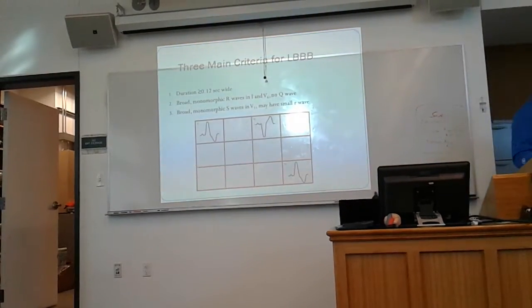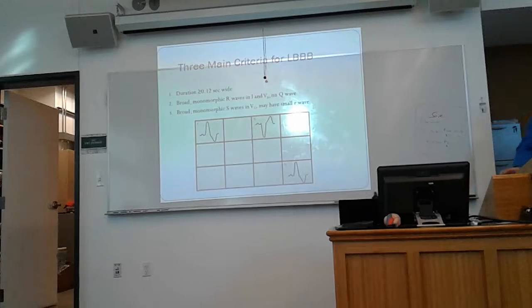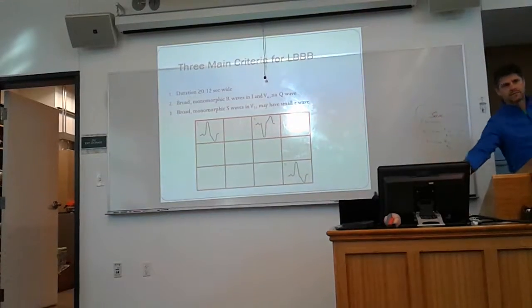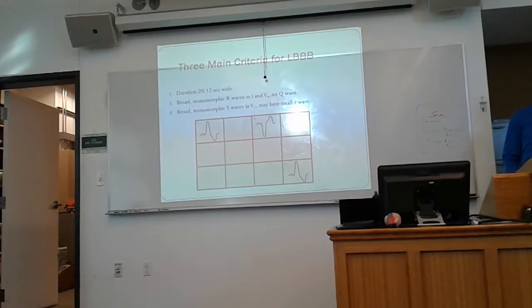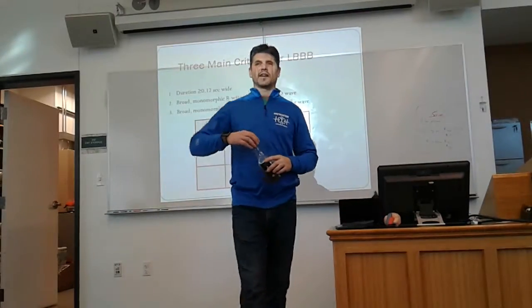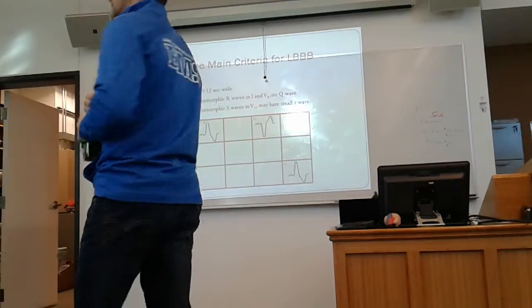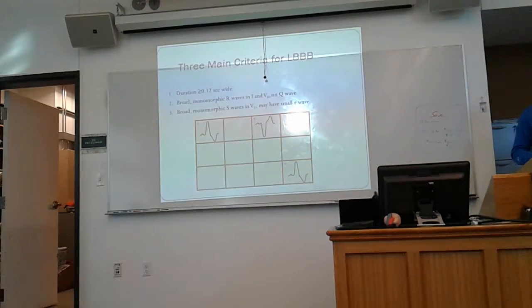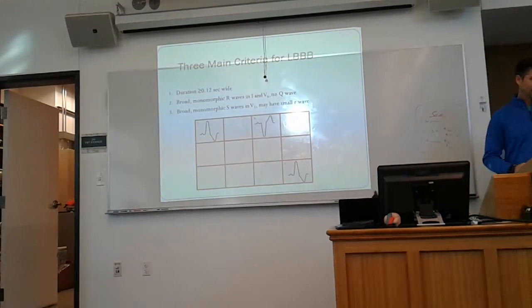And we have that. Hey, go back to your packet for just a minute. Just for fun, look at number 2. Look how wide that is. Is it supraventricular? Yeah. Does it have a wide QRS? Yeah. Look at leads 1 and V6. Do you have a weird all positive wave? Yes. Look at V1. Do you have a weird all negative wave with a positive T wave, to make it look like that hunchback thing? Yes. Guess what you have?